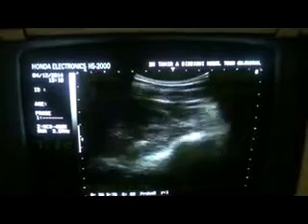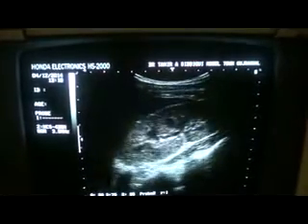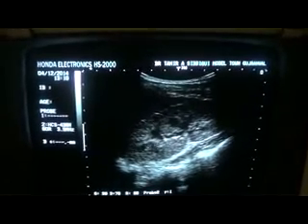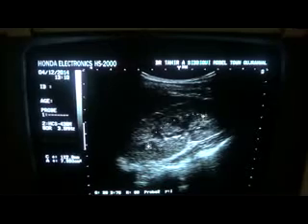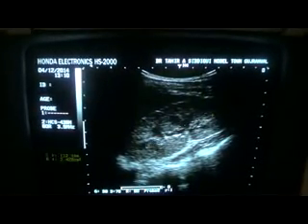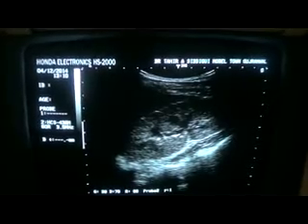What we have seen so far, number one, the echogenicity of the kidney is raised diffusely. Secondly, the second point that we see is that there is no central sinus echo complex fat seen. This is the area where you see the collecting system or the central sinus echo complex fat. It's absent in this patient. There's no fat seen. Rather, there is minimal, mild fluid within it. This is the second point.